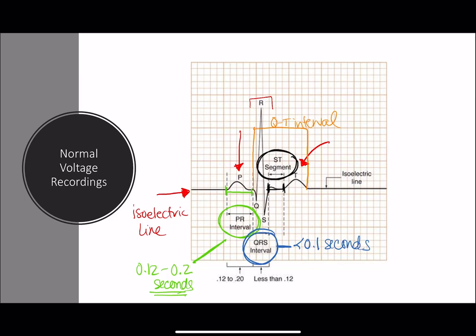We're going to go into more detail in the ischemia lecture, and actually in the later parts of the EKG lecture, about deviations to the ST segment. But that should probably sound familiar from pathophys when we talk about ST segment elevated myocardial infarction. This is actually what we're talking about. So our STEMIs cause an elevation of the ST segment.